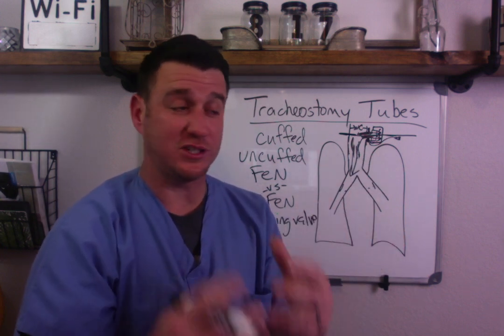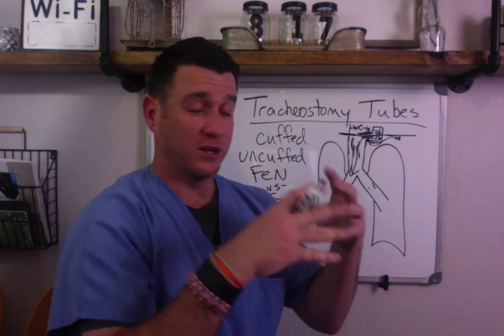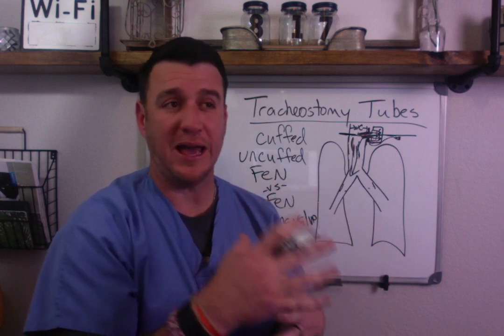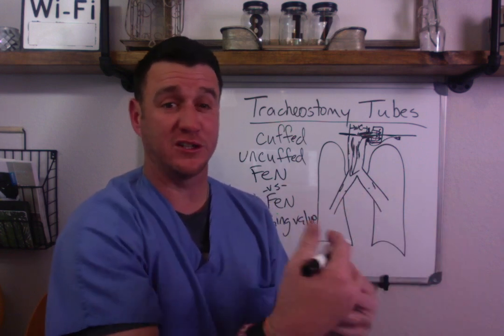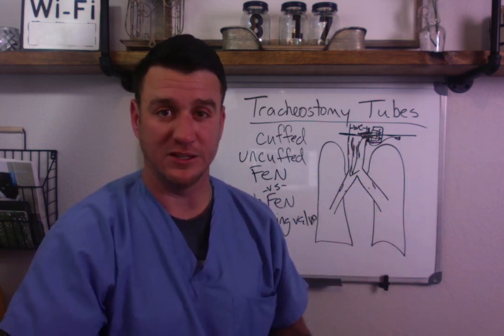So anytime you have to suction a tracheostomy tube, ask yourself, do I have a fenestrated inner cannula in? Because if I do, I may cause harm to my patient, because that fenestration will allow my catheter to slip through and possibly cause complications.